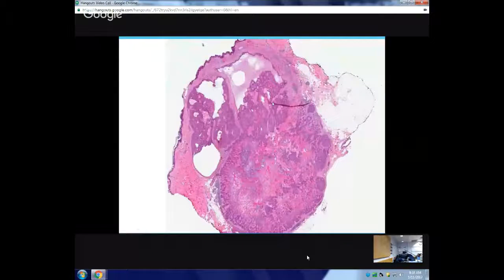So this is a hidradenoma. What is the complete name of a hidradenoma? Nodular and cystic hidradenoma. That is how it is described. Nodular and cystic hidradenoma. As the name says, it is nodular, so big nodules in the dermis, and usually they are cystic actually. So you're always going to see some cysts.